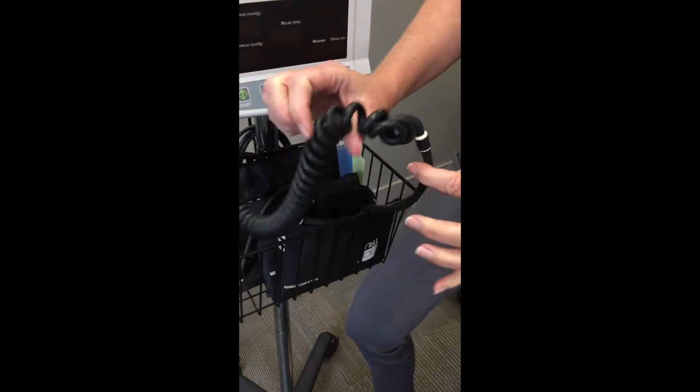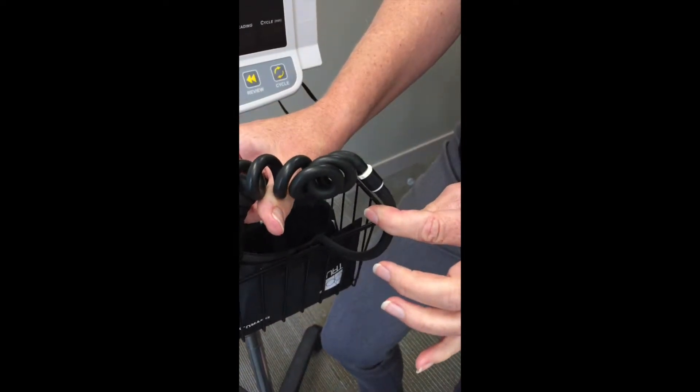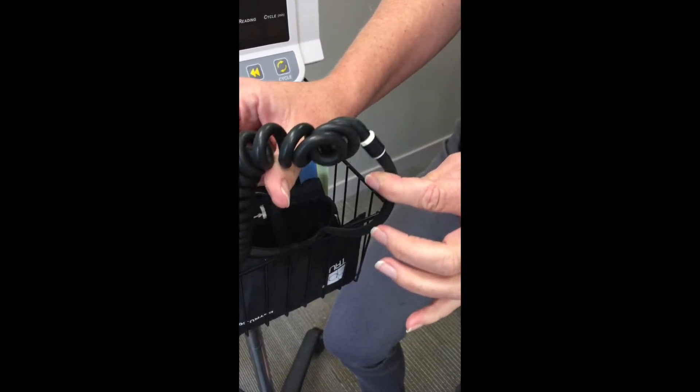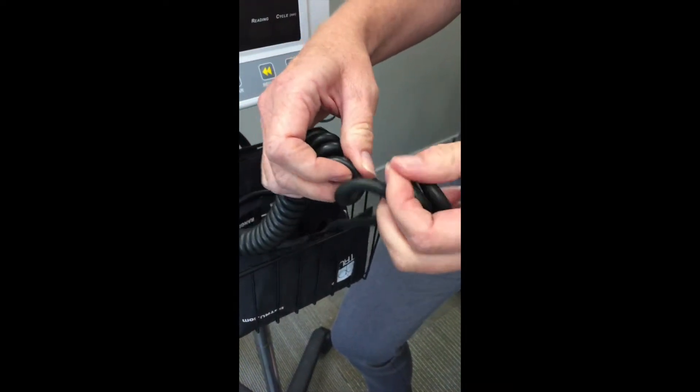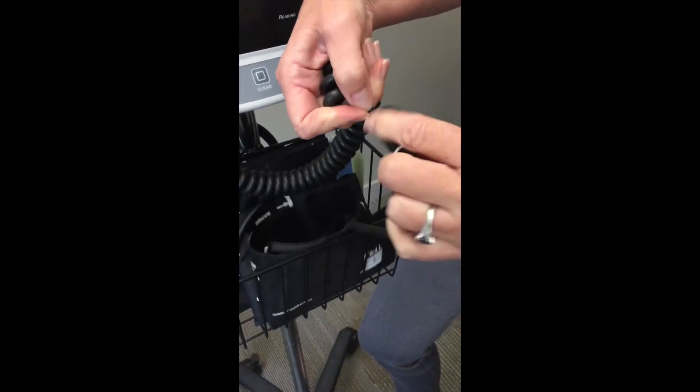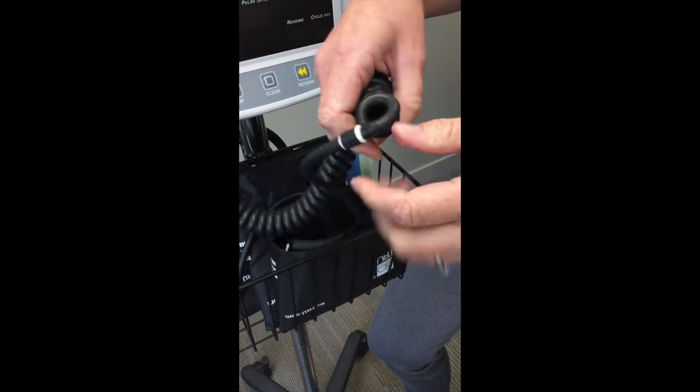Another common problem is twisting of your cord. This will actually affect your blood pressure reading as well. Take your cord and straighten it out just by twisting it along until it is all nicely coiled.